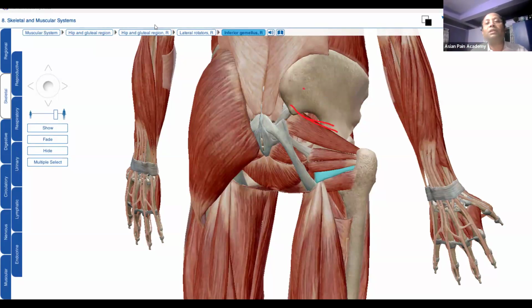So first one was here, then I came here. Actually, while doing the ultrasound of the hip from the posterior side, we start from the posterior superior iliac spine, from here. Then gradually we come posterior, to this area. So in this area, position number one, what will we get? We will get three muscles: gluteus maximus, medius, and minimus.